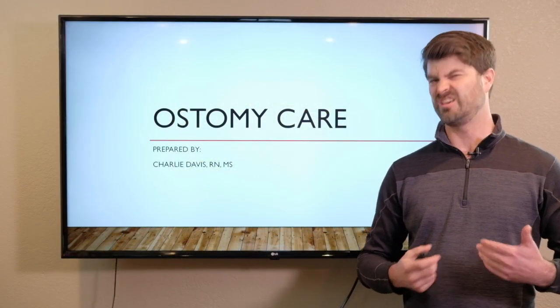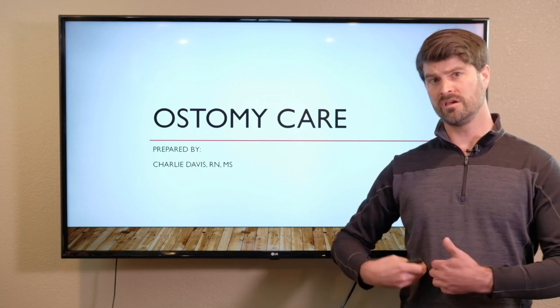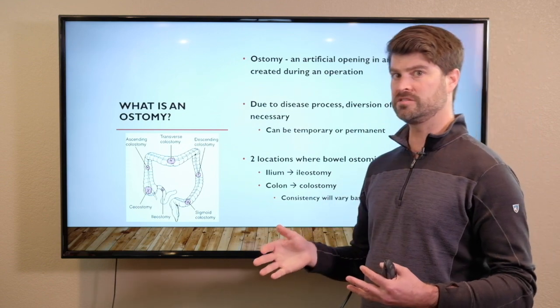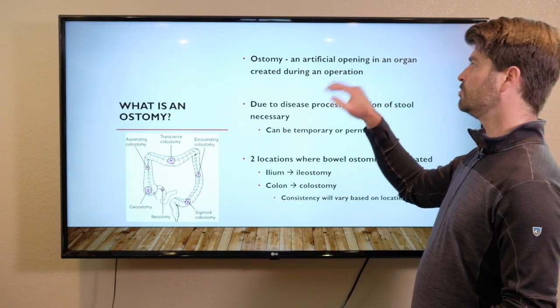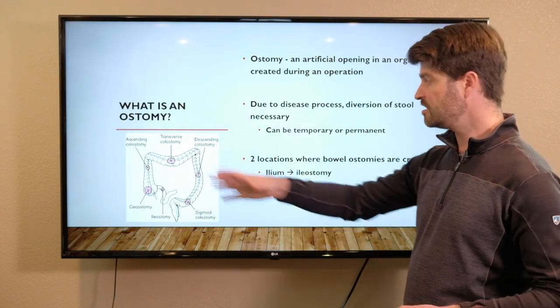So the next skill that we're going to talk about is ostomy care. We're taking care of a patient's ostomy that's been surgically placed. So first, what is an ostomy? Ostomies are artificial openings into an organ system that's created during surgery. So in this case, it's the bowel.